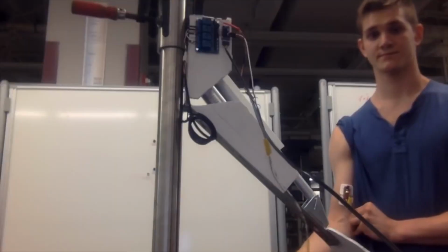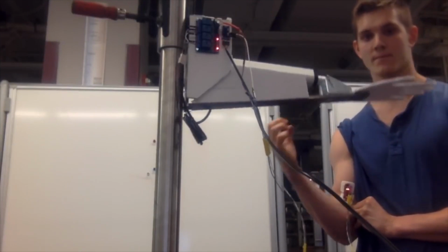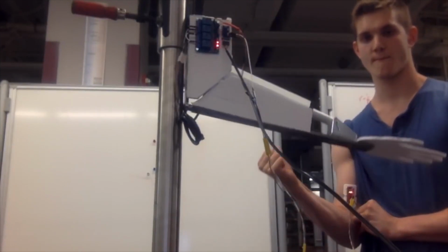New project. We're going to be building a robotic hand that's controlled either by brainwaves or by electrical activity in a muscle. I haven't decided which yet. We're going to try both. You may recall the prosthetic elbow project from earlier. Well, it's 4 years and 2 engineering degrees later, so let's see if we can't do a little better.